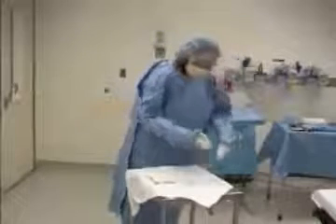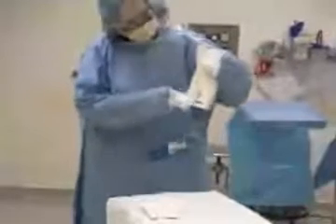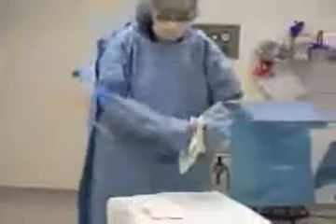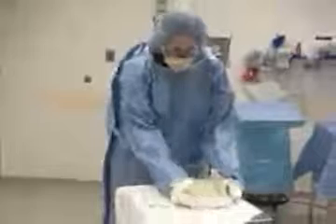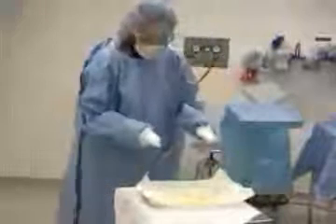An easy way to put your gloves on by yourself: take your package — notice it has the name Encore with 7 on it. Turn the package upside down so the fingertips of the gloves point towards you. Notice the left and the right are upside down. Open up the package. Notice I'm not using the cuff part — I'm using the blue part of the gown above the cuff to open this, and I'm watching where my hands are at all times.